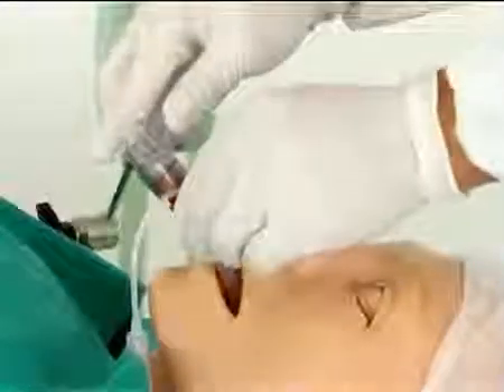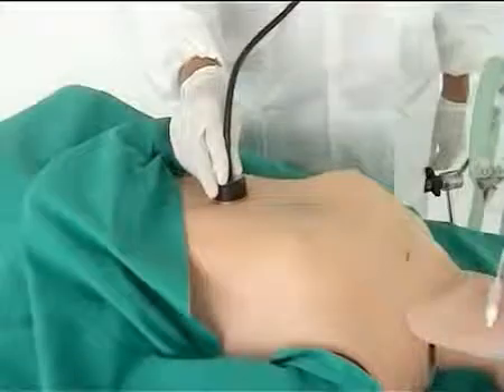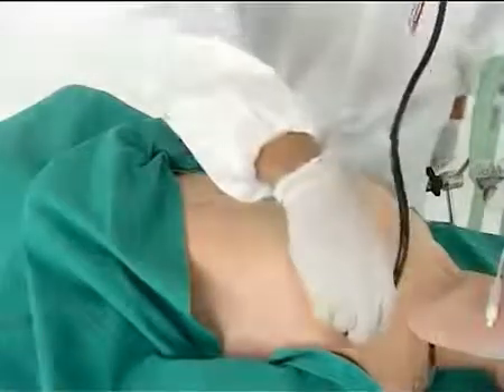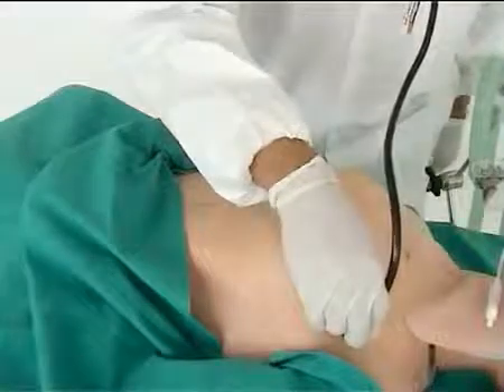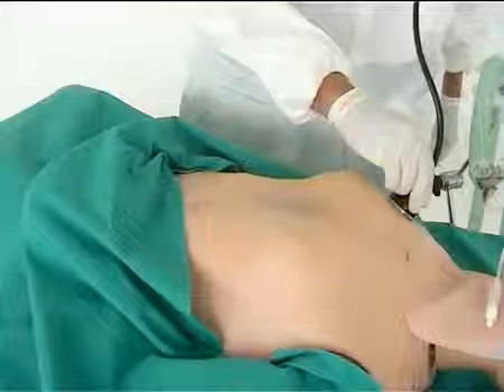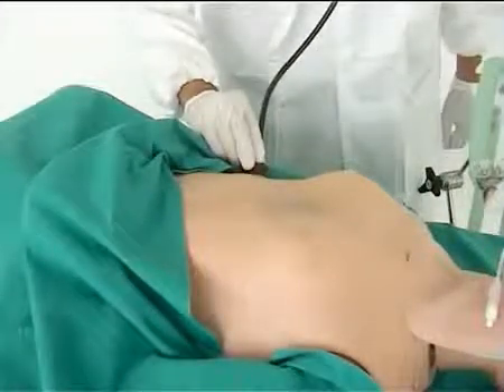Then connect the LTS to the breathing circuit. Check sufficient ventilation by auscultation of the lungs, chest movement, and capnography. If ventilation is not sufficient, the LTS can be repositioned slightly between the teeth marks.